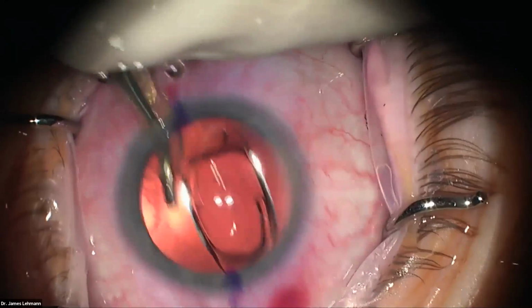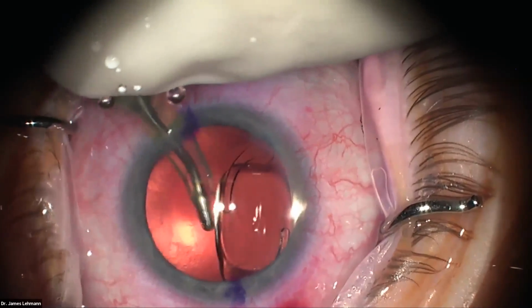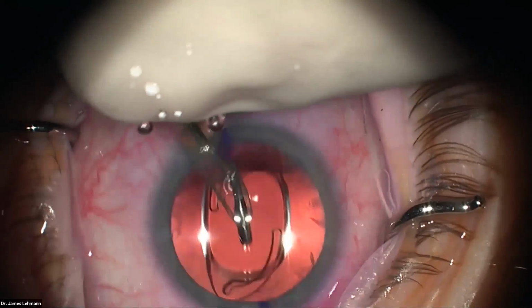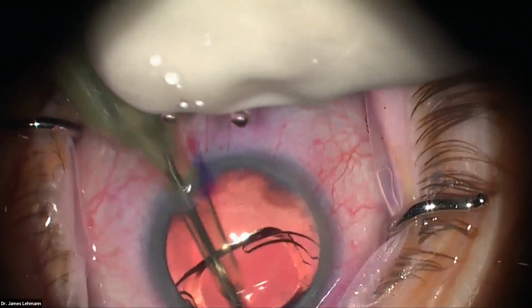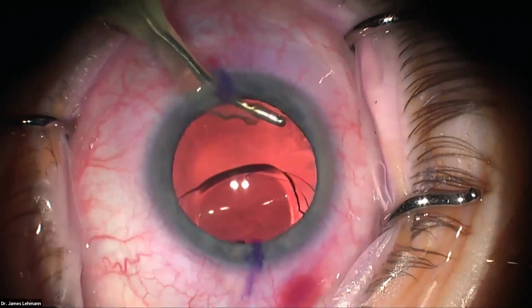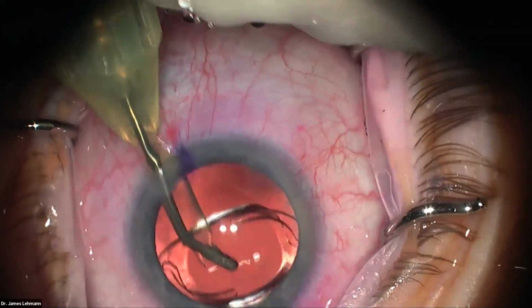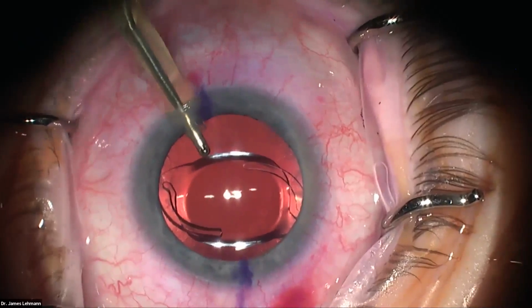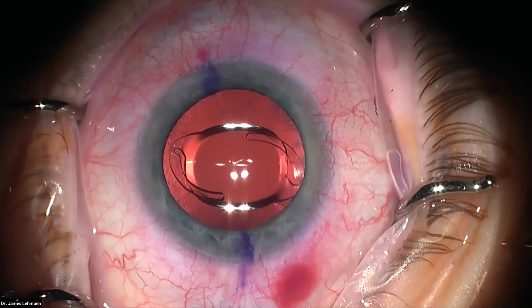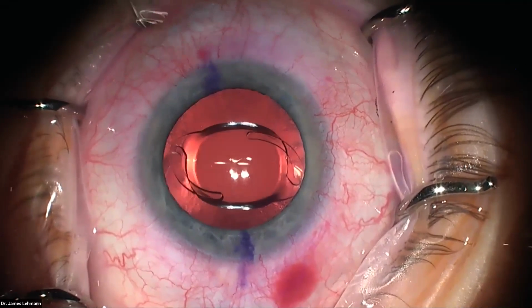I'll go here behind, or at least to the side of the optic, to get all of it. So everything in the bag has come forward. I can see that. I'm centering the lens. And now I can put the pedal to the metal and just keep it here in the anterior chamber. And I don't see much happening now. That tells me that a lot of the viscoelastic is gone. So I'll get that lens a little more in the center, and then I'm going to turn off the continuous irrigation and remove it. You can see how I clearly see the back of the capsule. I clearly see the optic has come forward. That tells me there's really no viscoelastic left.